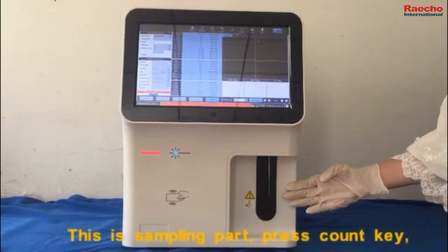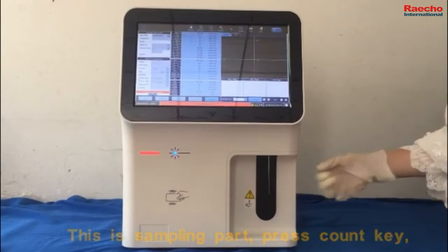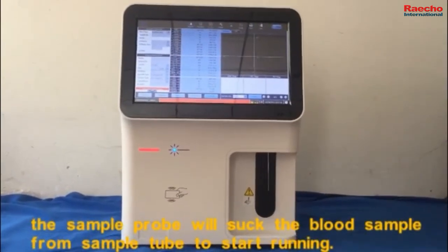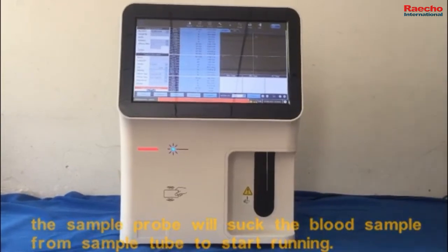This is the sampling part. Press the count key, and the sample probe will suck the blood sample from the sample tube to start running.